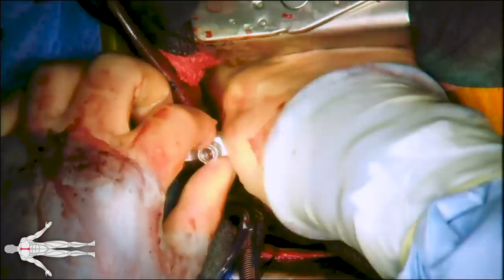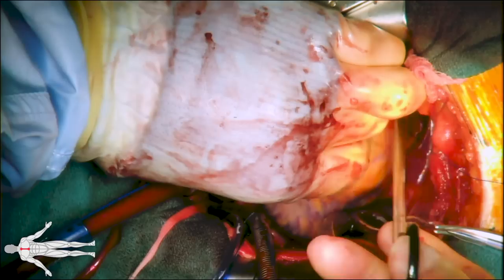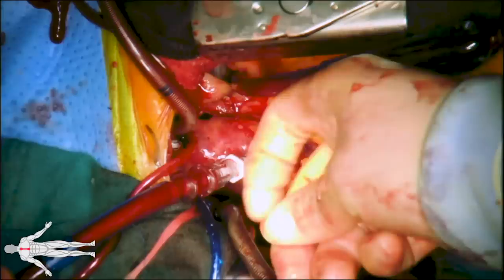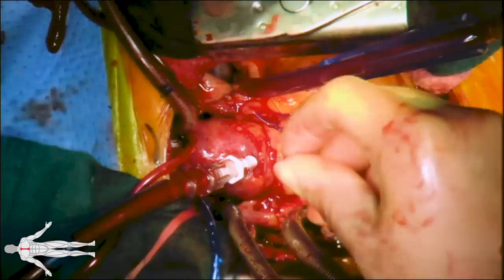A de-airing needle is placed prior to removal of the cross clamp. Once the heart is de-aired, the aortic cross clamp is removed. Ventricular pacemaking wires are then placed, followed by placement of atrial pacemaker wires. This concludes our demonstration of heart transplantation.